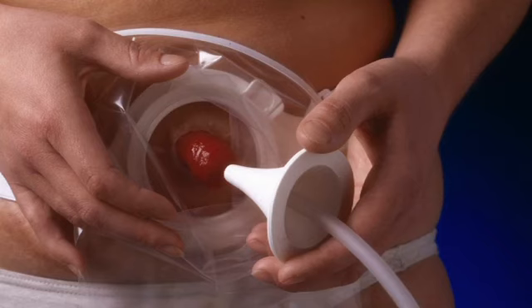It is recommended that training can begin no sooner than 10 days after surgery. Irrigation should not be done occasionally, it should be done routinely every 48 hours. Since irrigation takes up to an hour, your family members' routines of using the bathroom should be considered.